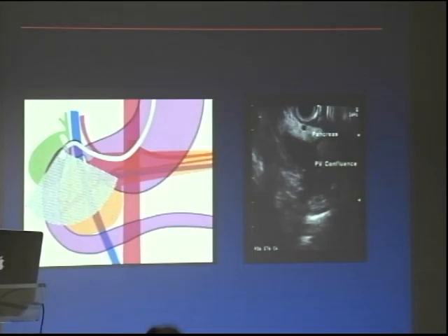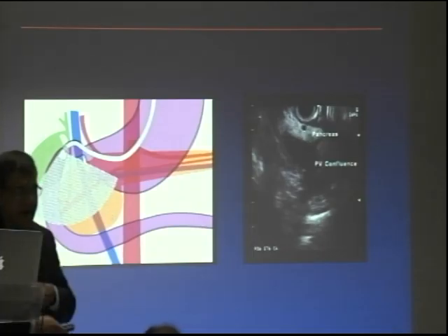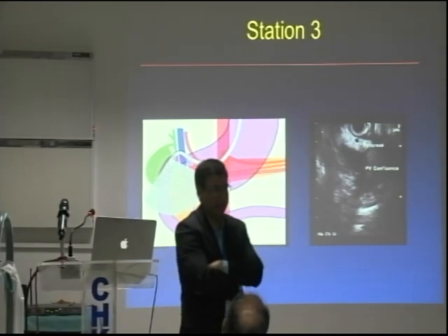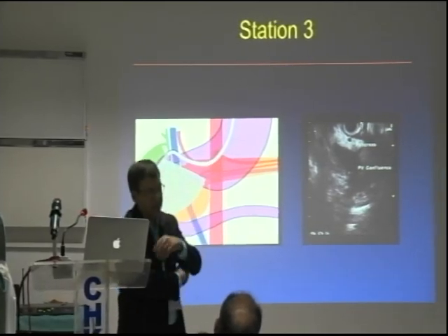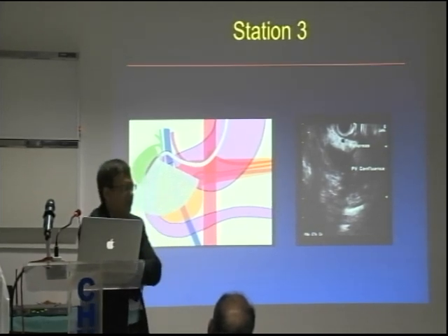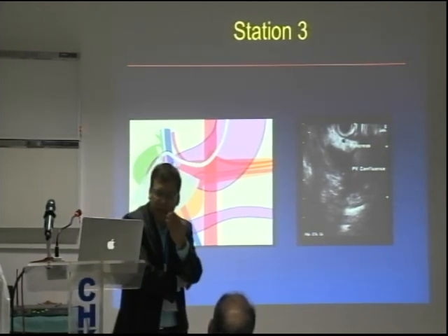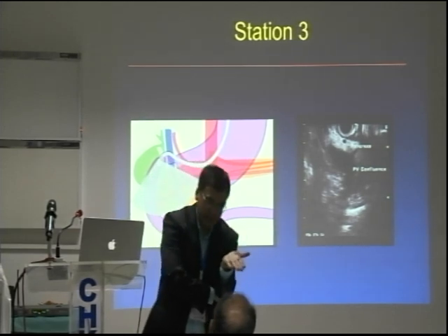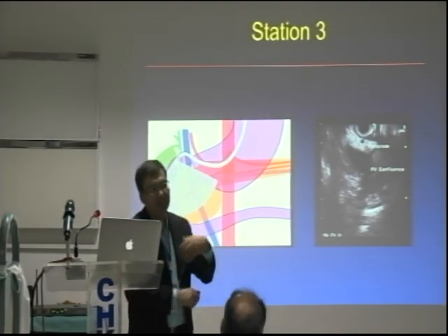So that is going to happen. You will fall back and you're not satisfied with the examination. That happens. You always go back to the station. Sometimes you have to do it 2-3 times, especially when you're coming back from the descending duodenum, and sometimes it just falls back.